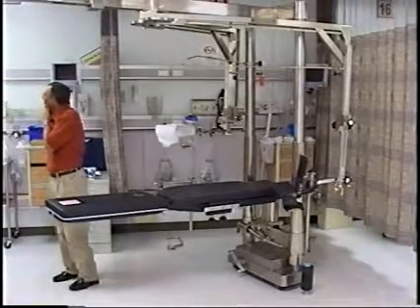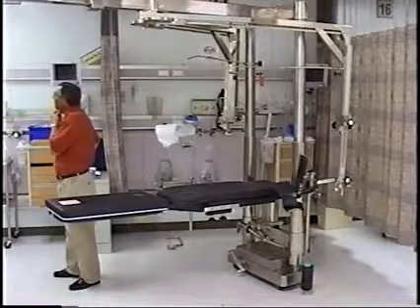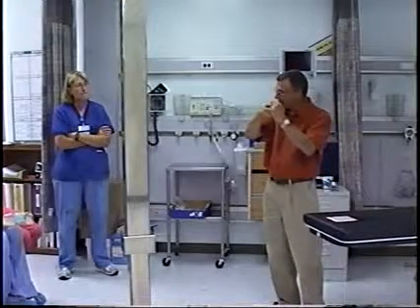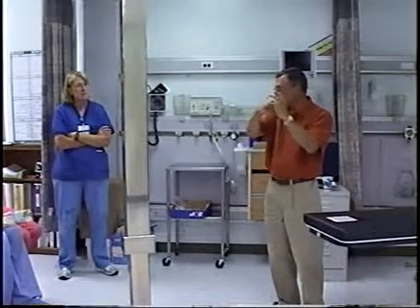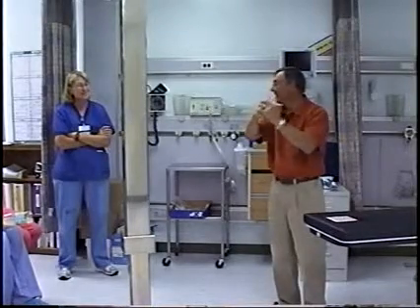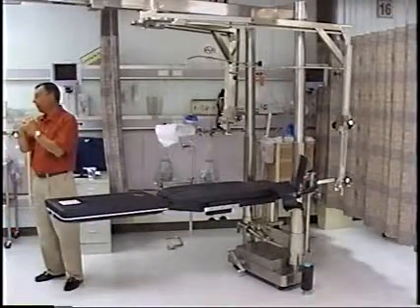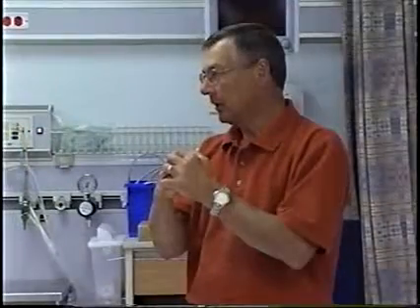I hadn't really thought about using the chick table to do a scope, but that would give you great traction. Oh, absolutely. That opens up the hip space. Yeah. All he's doing is he's just pulling enough traction to move the ball of that hip, okay, out away from the acetabulum. Move it out enough so that he can get a scope down in there. And generally, regardless of how much he gets out of that, he won't pull more than 2 hours of traction. Even if he's not finished, he says, that's enough, let's quit. But we're seeing that more and more.